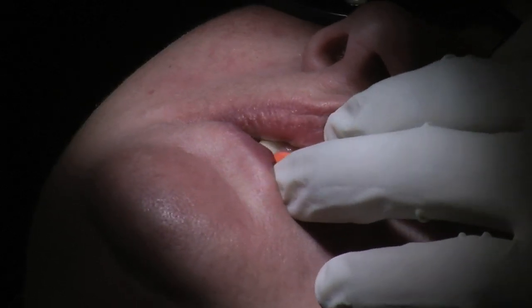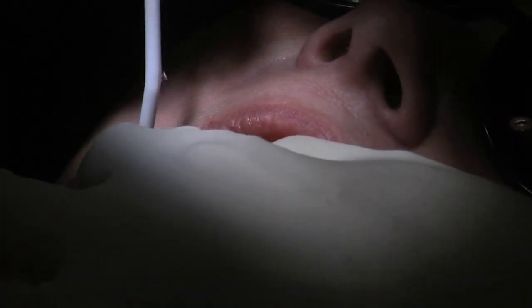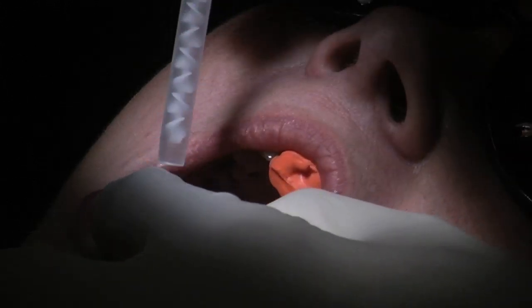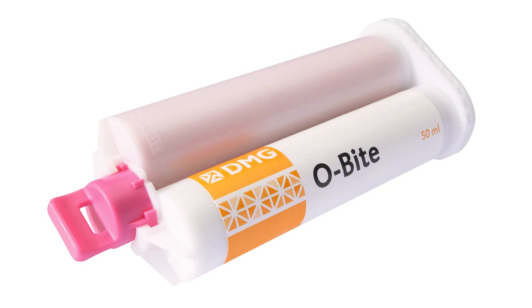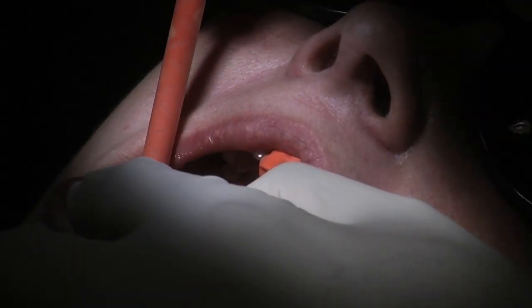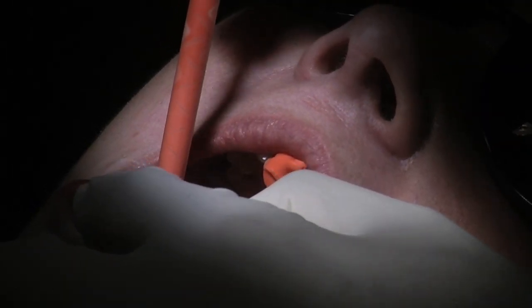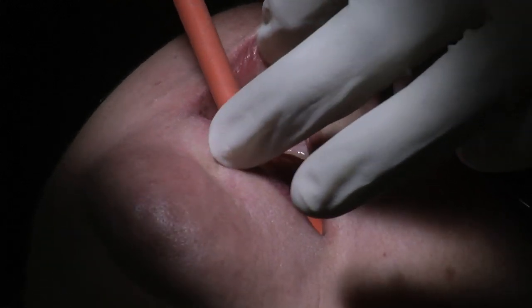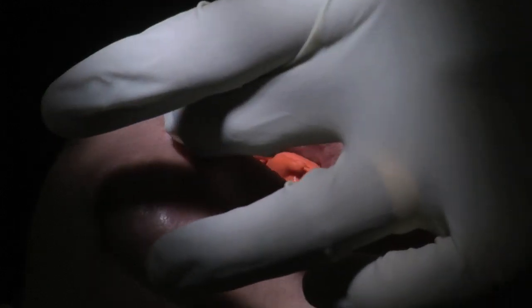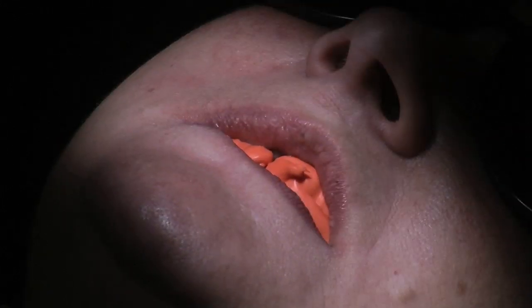So all I need to do now is open. I'm going to tell you to bite in just a minute, and you just bite together properly when I say. So I'm just going to put some O-biter new fresh mix here on the lower teeth maybe, just here, very carefully arranging it. Wider surface area on the occlusals, and put it down there. I want Dina to bite firmly — bite now — and keep together now without letting go. Literally just add a little bit more there. That's going to be a nice bite registration taken.